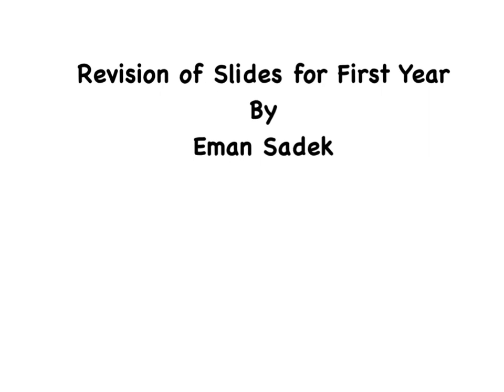Bismillah ar-Rahman ar-Rahim. This is the revision of slides for the first year.